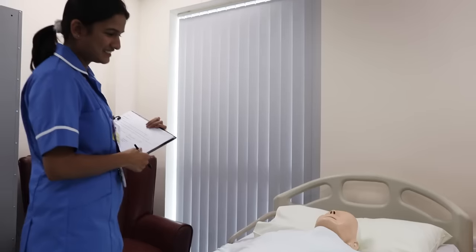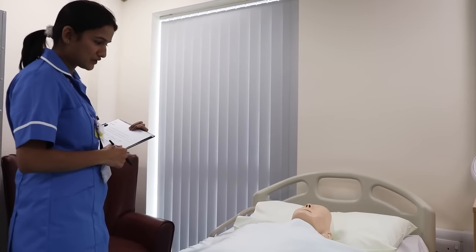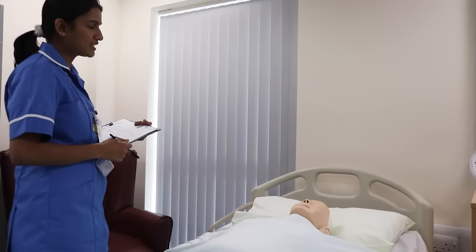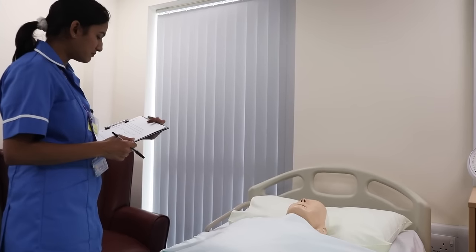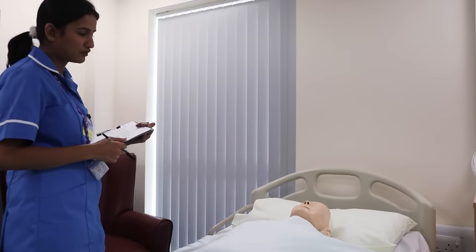Hello, good morning. Hello, how are you? I am great, thank you. Okay, so my name is Sugandha. I am your nurse for today, and I will be taking care of you. But can I confirm some details with you? Can you please tell me your full name?